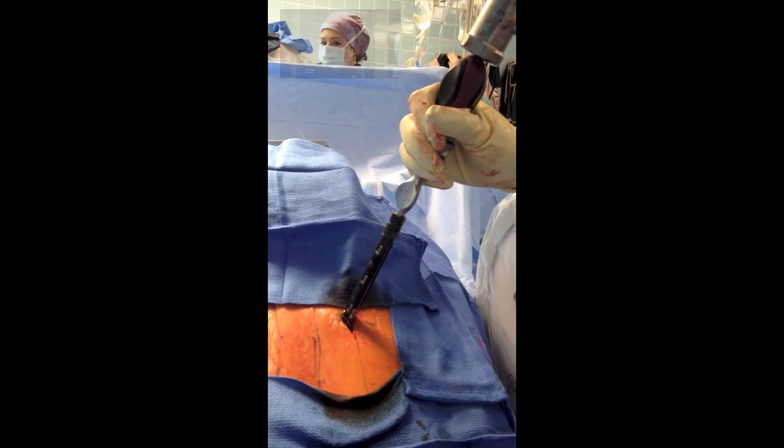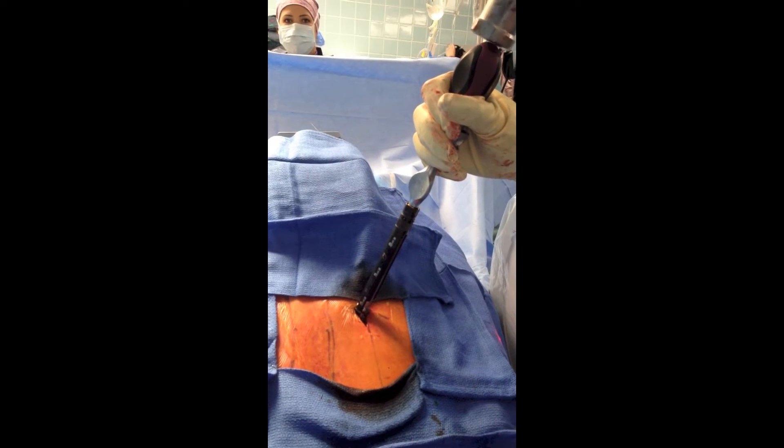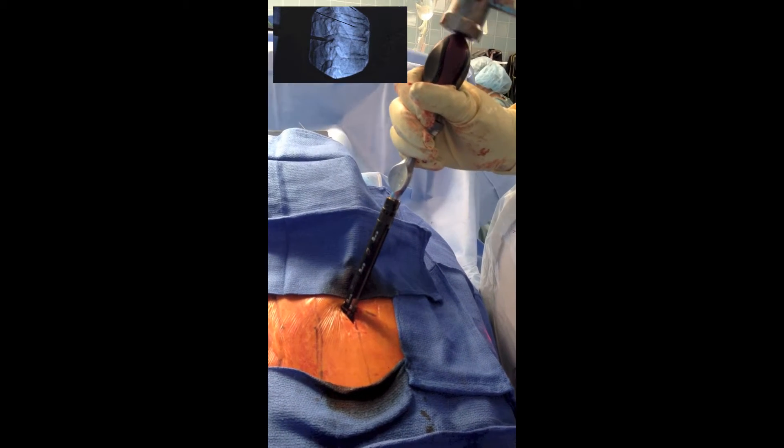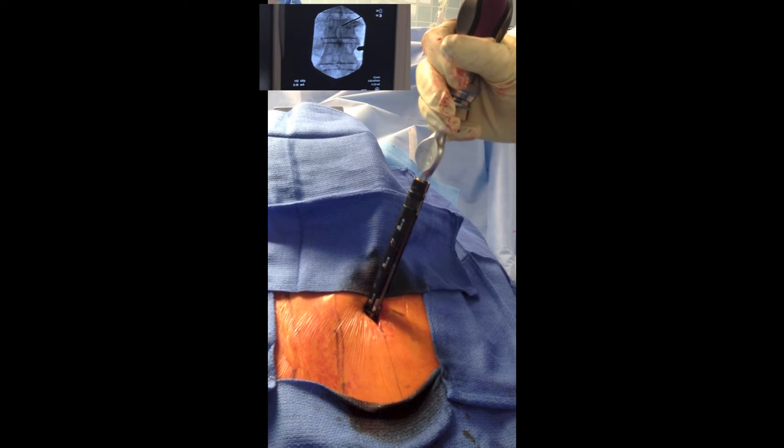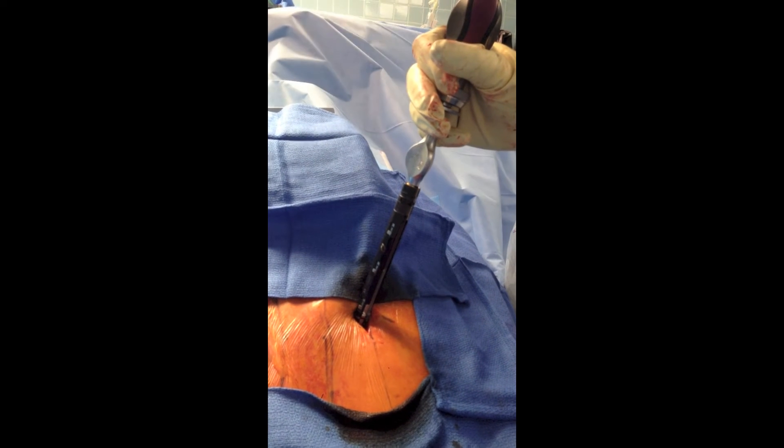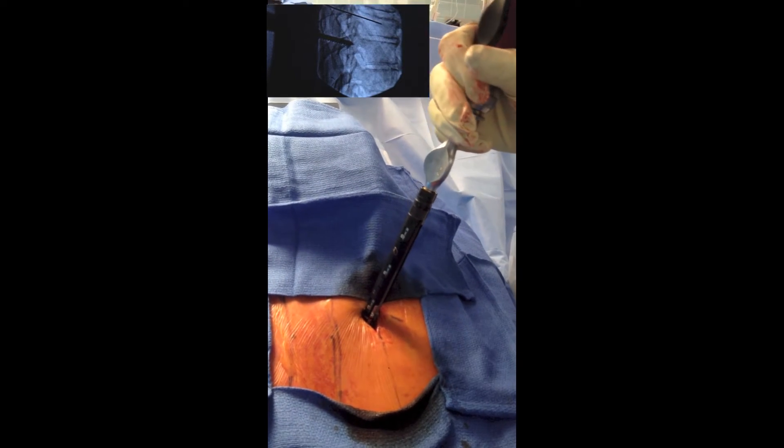Next, a mallet is used to dock the sharp-tipped screw in a similar fashion to the Jamshidi needle. Once the threads engage, downward pressure is applied as the driver is turned and the screw is advanced.